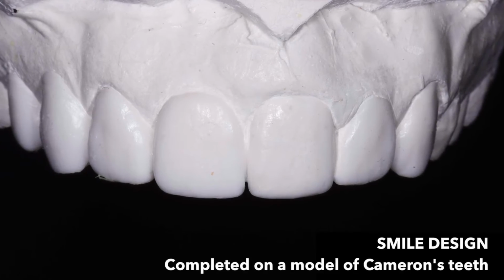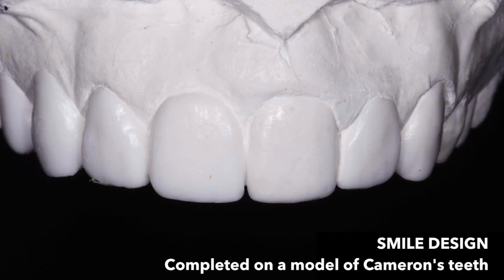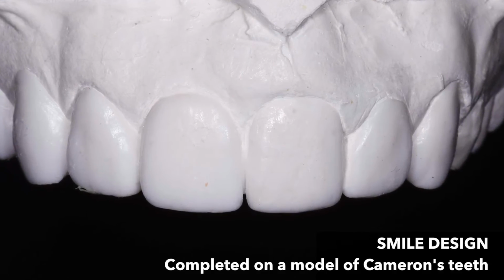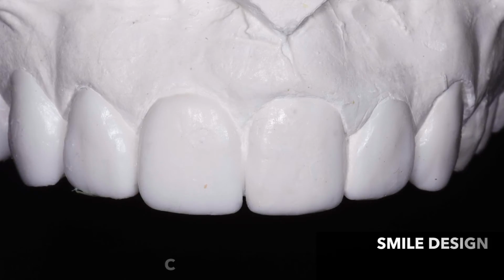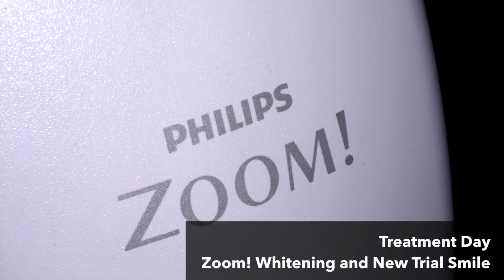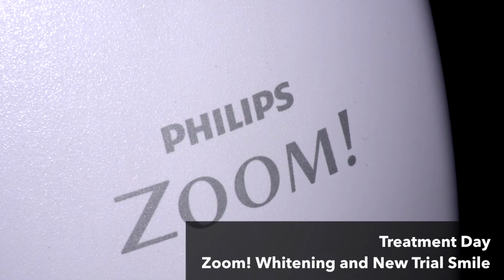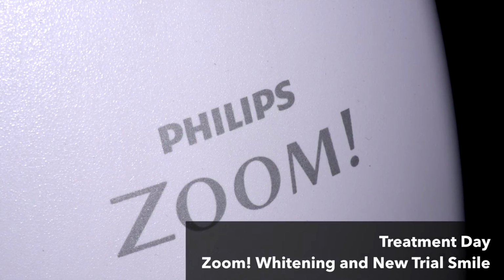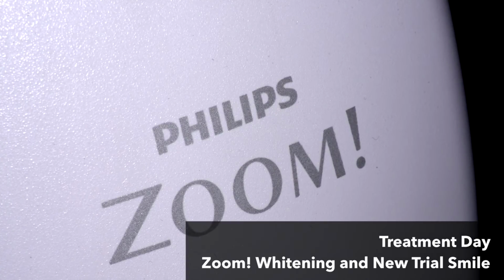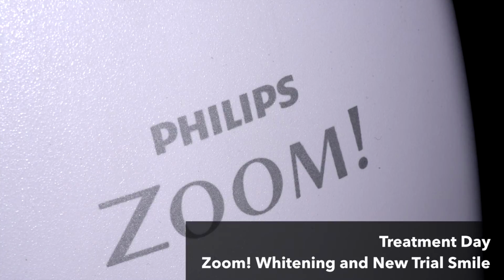Cameron decided to go ahead with treatment. So his first visit, after we've redesigned the smile on models of his mouth, was that he wanted to do whitening. So this is Zoom whitening. It's probably the most effective whitening that we can use. It's been around for a long time, and it's in-chair whitening, and it's termed laser whitening, but it's just, I suppose, a very fast and very thorough way to do whitening, really to get the best whitening results.